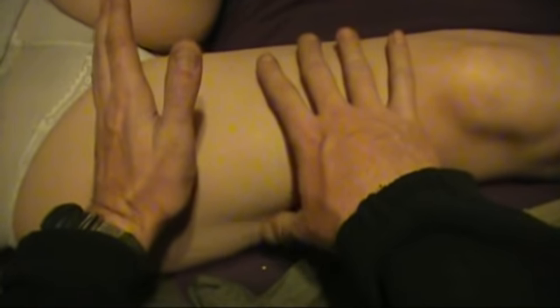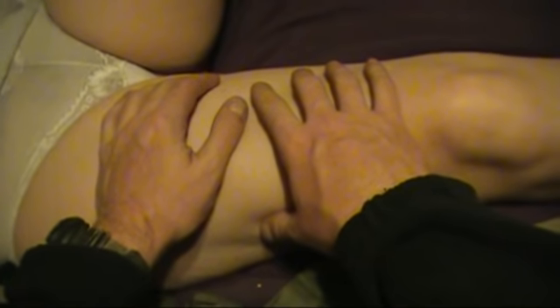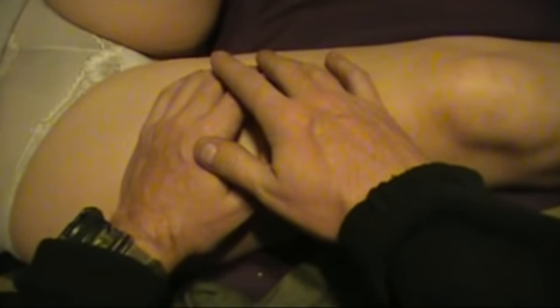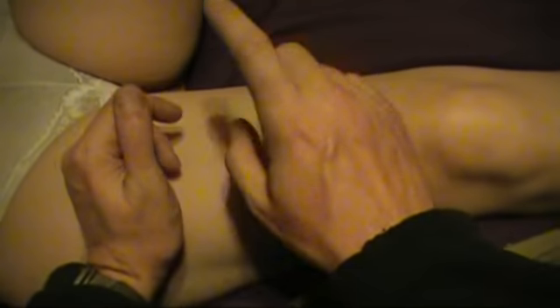Now, a tourniquet is for uncontrollable arterial bleeding. Okay, keyword being uncontrollable. Arterial bleeding, especially from a major blood vessel such as your femoral artery, can kill you very quickly. We're not going to get into numbers, just ridiculously quick. Also, arterial bleeding is unlike anything you've ever seen. It's an insane amount of blood gushing out, spurting out, spraying you, spraying the walls. Anyway, tourniquet is for uncontrollable, but the first thing we're going to do is show you how to do controllable.